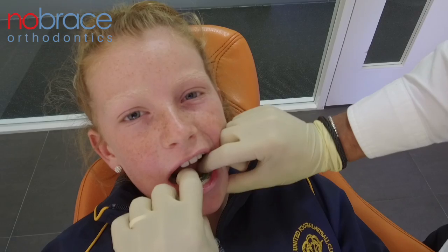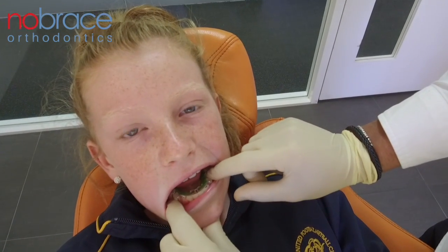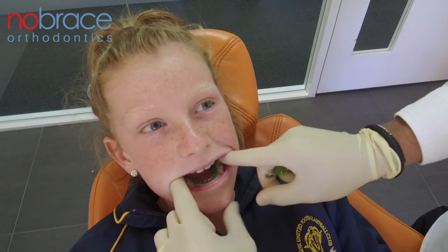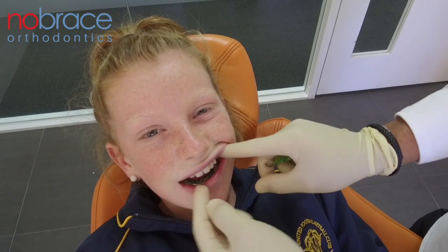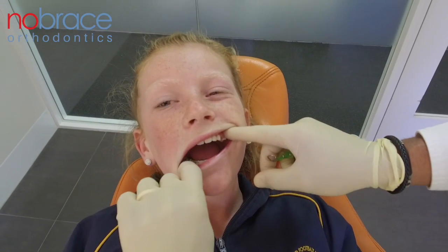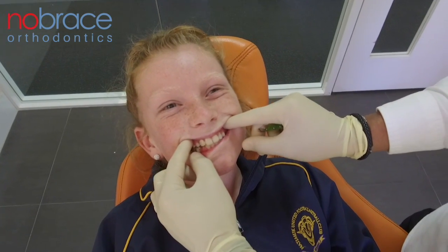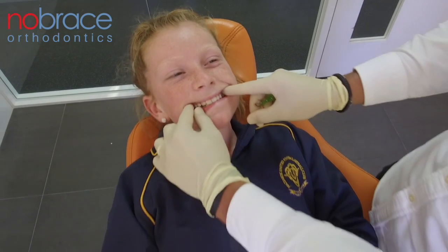This plate is sitting here protecting the space and allowing the permanent teeth to erupt where they would have otherwise been blocked out. On the upper, she now has a nice broad upper arch and a really nice bite. We're waiting for the rest of her permanent teeth to come through.